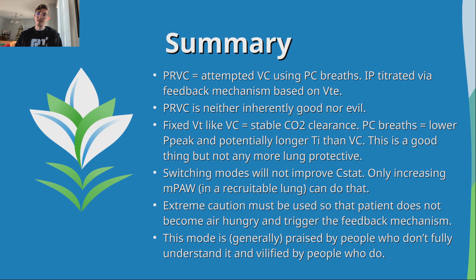I had somebody try to say, well, isn't it better in a patient with variable lung mechanics, like ARDS that's improving or getting worse, because it can titrate pressure breath to breath? No, it's not, because in volume control, the vent is not having to titrate anything. It's just delivering X flow for X amount of time to get X volume. It doesn't care what the pressure generated is, okay? It doesn't have to do any calculations. It's just going to do that, and it's going to happen.